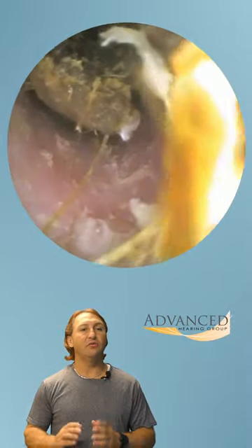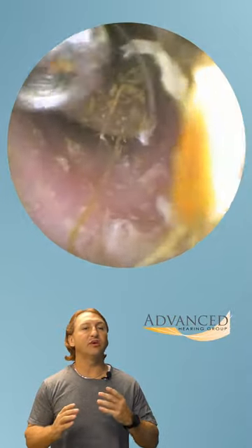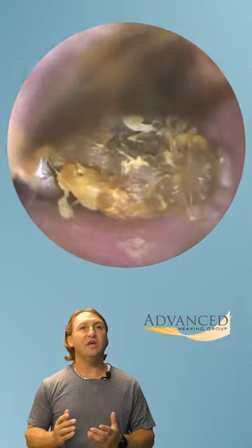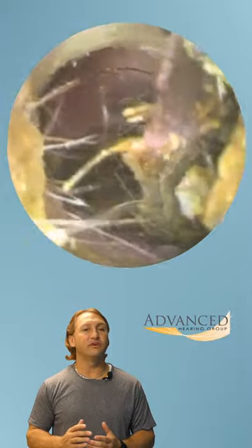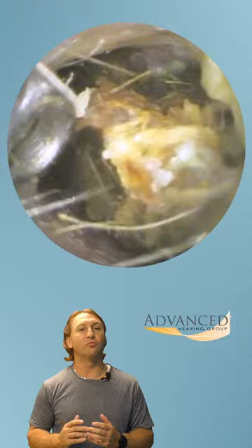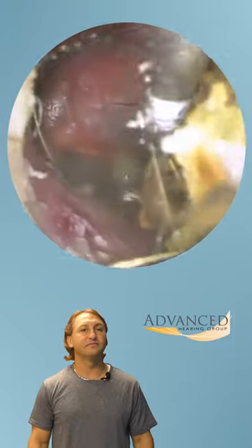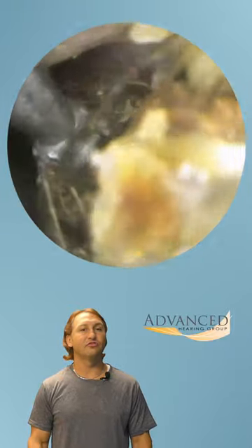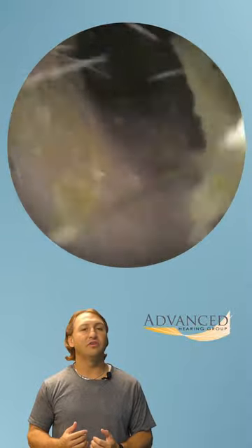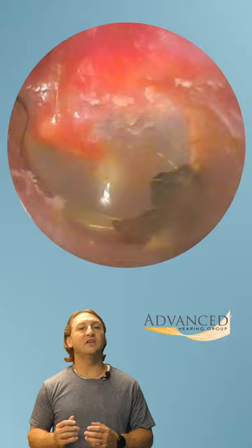So now we're going to use the curette once again to get underneath that earwax and pull it up, then try to break it away from the ear canal ceiling, giving us a good view of the eardrum. Let's see what we get as we pull this out — and there's the eardrum. You can see how that all released at the same time. As we look back in, we can now see the eardrum. It's actually a pretty good view there.